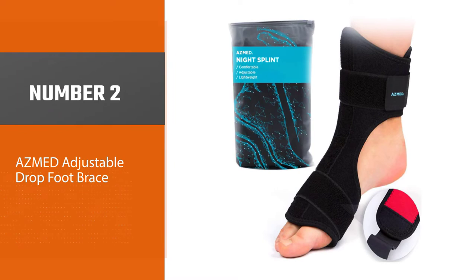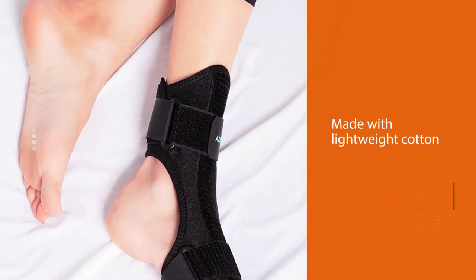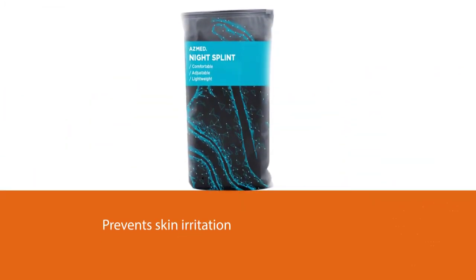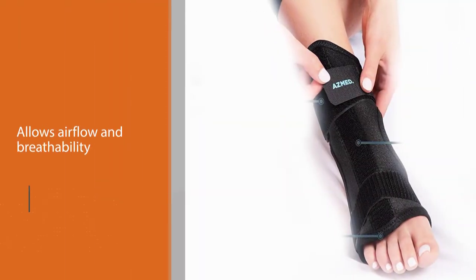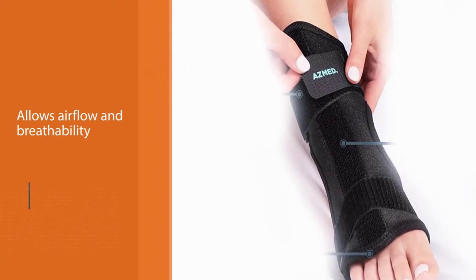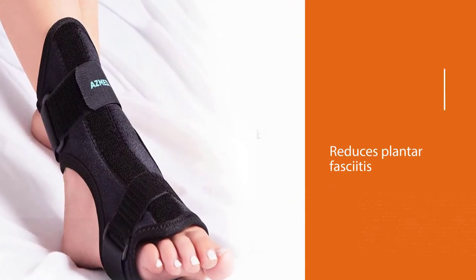Number two: Asmed adjustable drop foot brace. This adjustable foot brace is made with lightweight cotton and neoprene material. The soft interior prevents skin irritation and chafing, while the open heel design allows continuous airflow and breathability. It features a bendable aluminum strap to adjust the foot angle at 85 to 90 degrees for utmost comfort. It reduces plantar fasciitis and achilles tendonitis, and is suitable for relieving pain from foot drop, stress fracture, and foot injury.